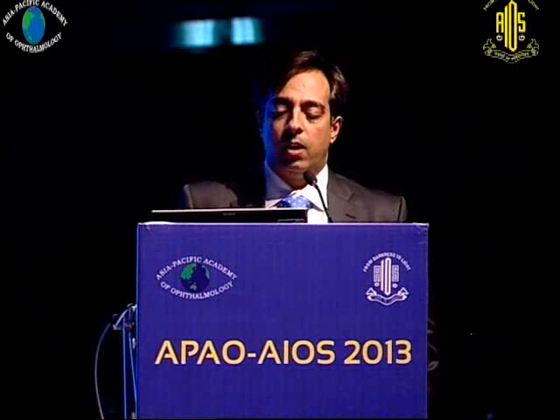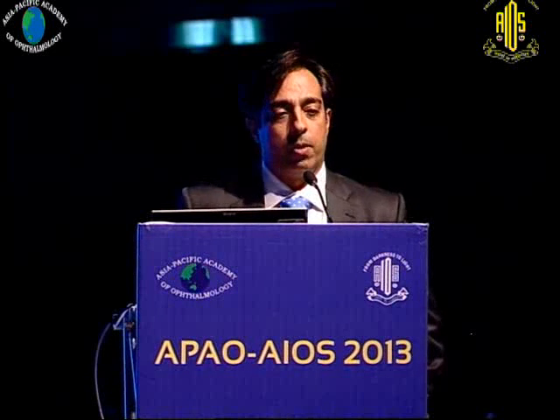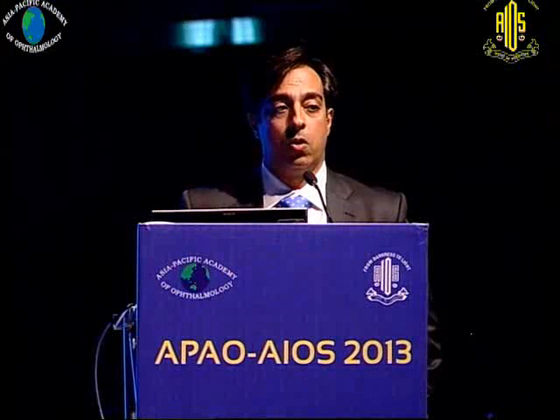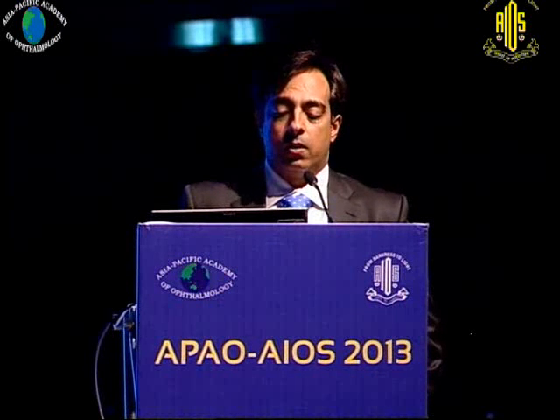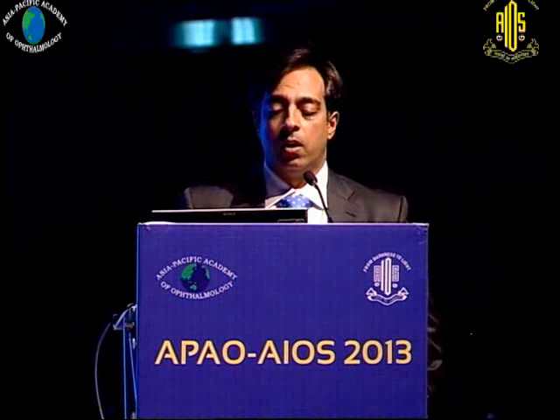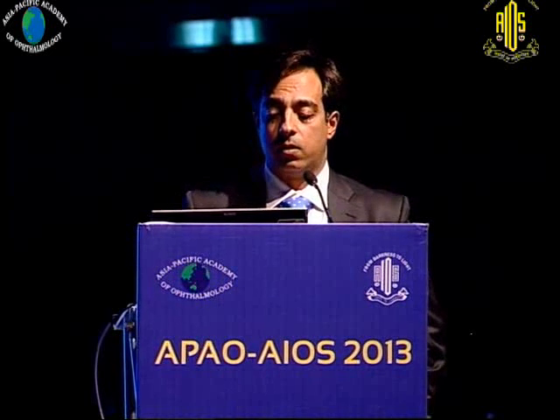So gently we grab the vitreous in such a way that we carefully remove the membrane along with the same process, and you don't need to separately go in and remove it. But of course you need to keep that area under very close watch, because the last thing you need is a rip in the retina if the adhesion is too strong. So you can see that the whole membrane has come off totally in this situation.